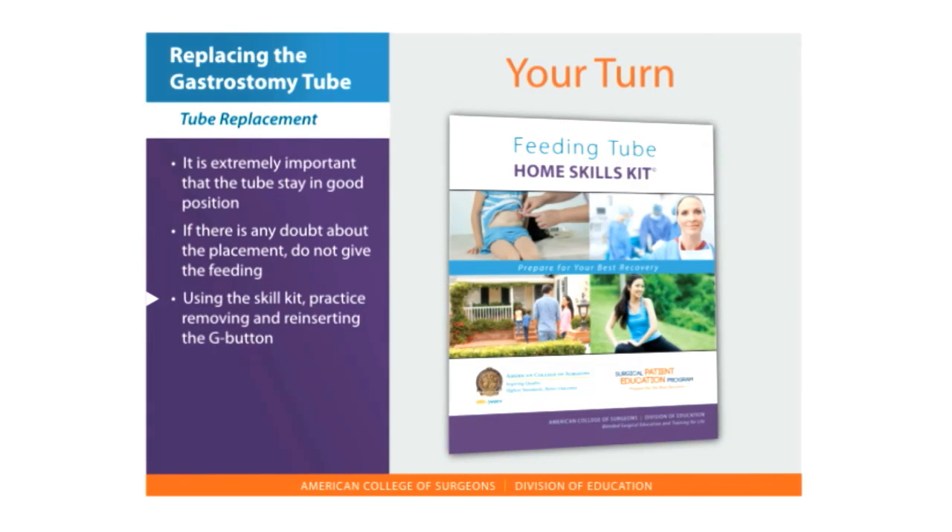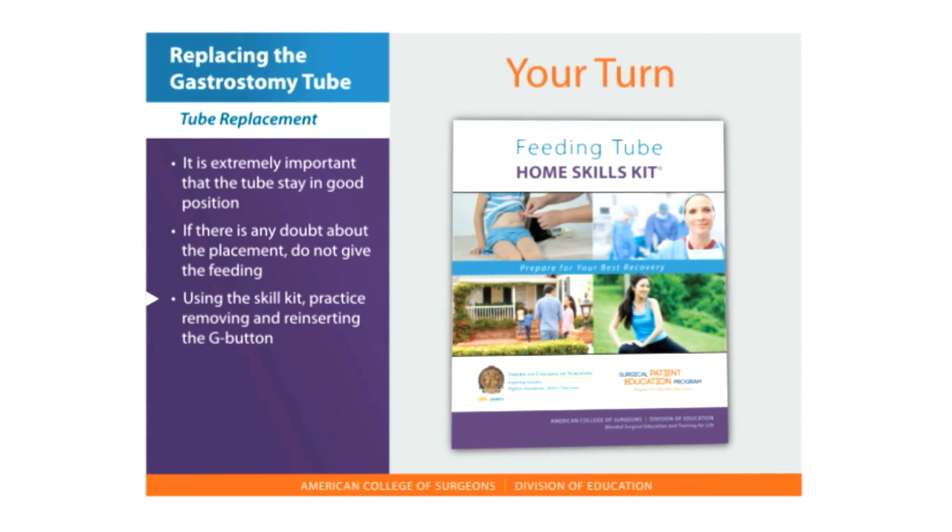Now it is your turn to practice. If you have a feeding tube skill kit, remove and reinsert the gastrostomy button.